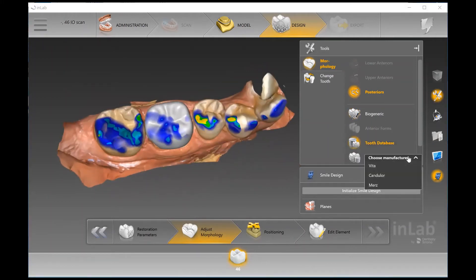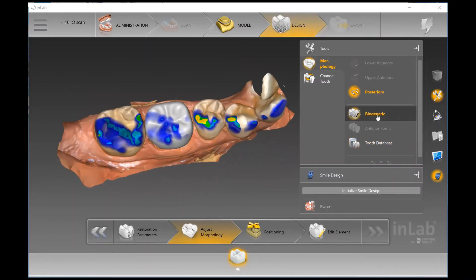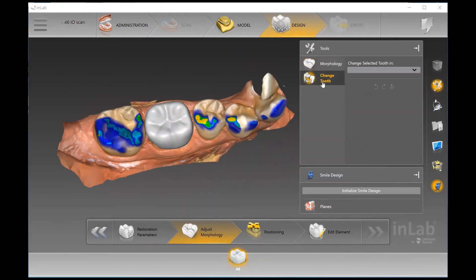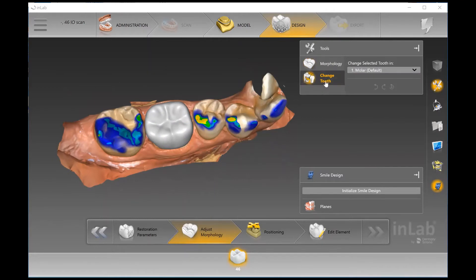We do have a tooth database where you can choose from a few denture teeth, which can come in handy if you're doing a crown next to a denture. However, Biogeneric would be most commonly used for just a standard anatomic crown.